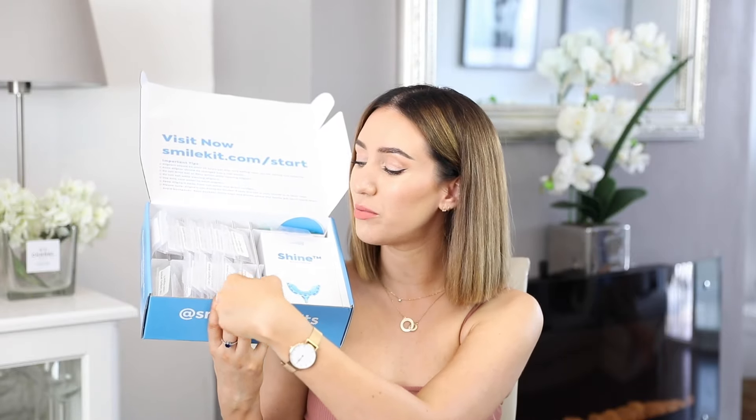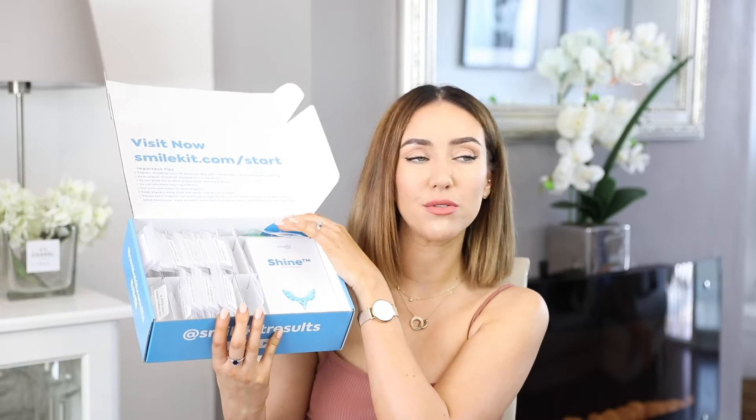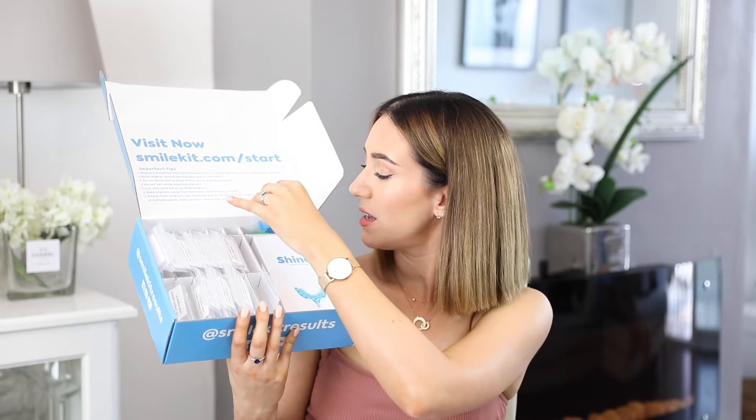Probably the most exciting part: all of my lower aligners are at the bottom, and that's five months of treatment. My upper aligners are at the top, which is six months of treatment. I change onto the next one every two weeks.